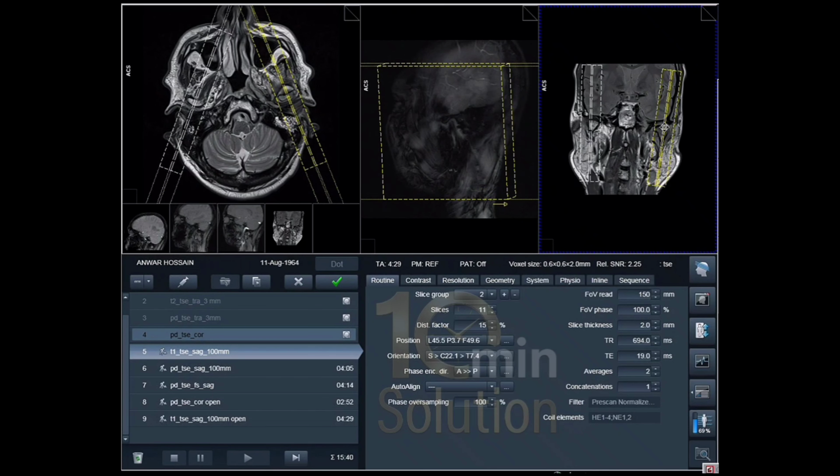So look here, and showing here the parameters. Okay, our plan is almost complete, and now the apply.